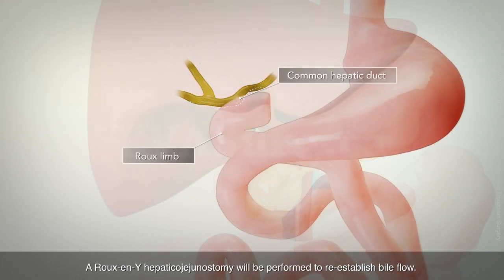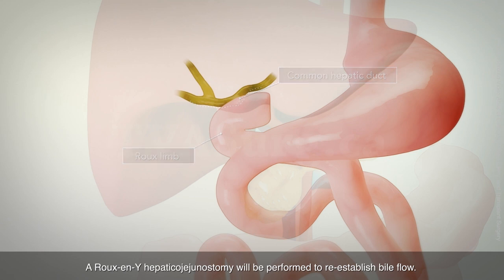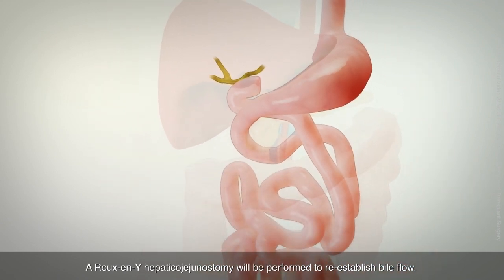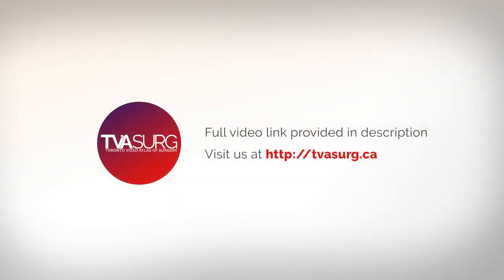A Roux-en-Y hepaticojejunostomy will be performed to re-establish bile flow.